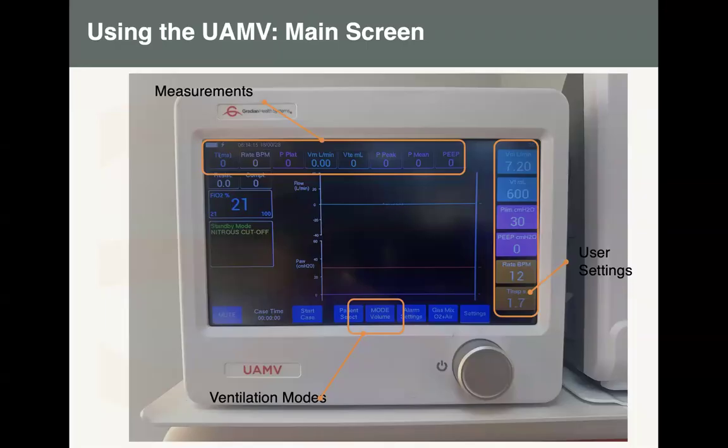Because remember, as much as mechanical ventilation is a good thing, it is also as bad as any medical intervention, where it has complications. So know what you have set and monitor what the machine is delivering, but also use clinical judgment, things like what Papicha has talked about, end-tidal carbon dioxide, things like oxygen content. We are using a pulse oximeter to know the amount of oxygen.